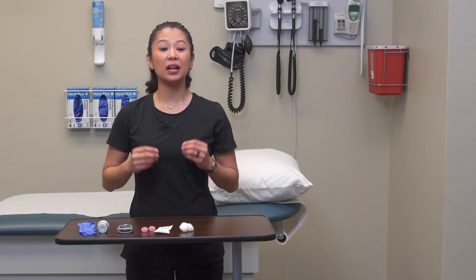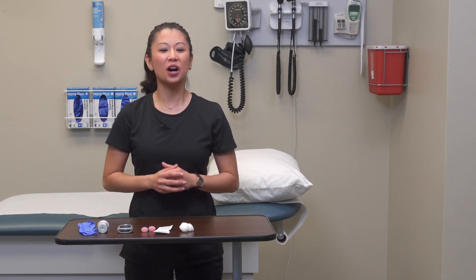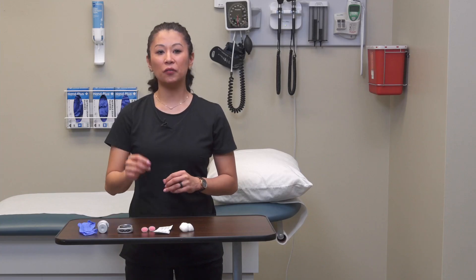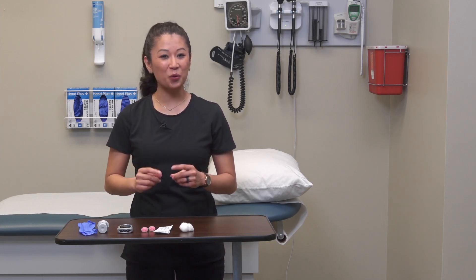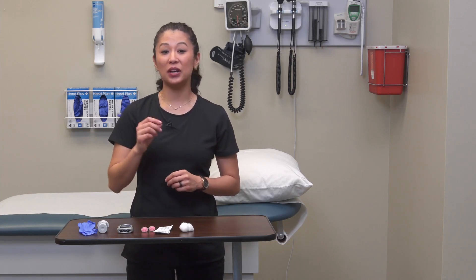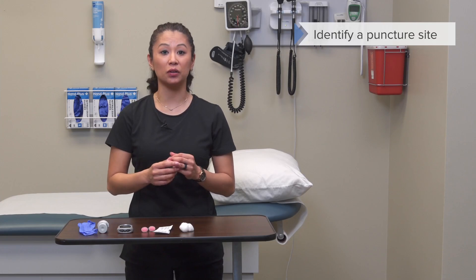Now let's take a live look at how we obtain a blood glucose sample. I'm going to demonstrate this on myself today. After performing hand hygiene and explaining the procedure, make sure you have the right patient by using two patient identifiers — the patient's name and date of birth.